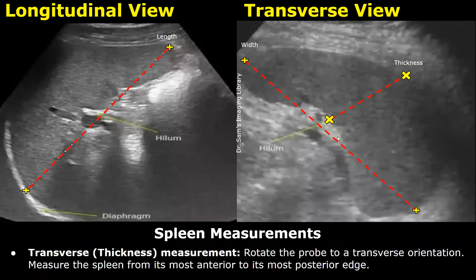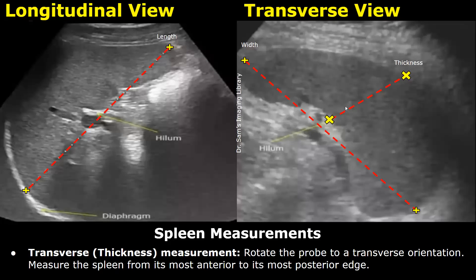To measure the thickness of the spleen, place one caliper at the anterior margin of the spleen and the second caliper at the posterior margin, and you will get the splenic thickness. Take this measurement at approximately the center of the spleen, from the point where you see the hilum all the way to the other edge.